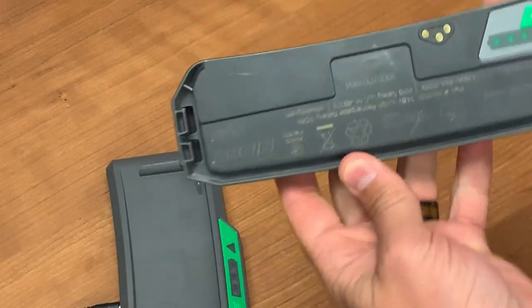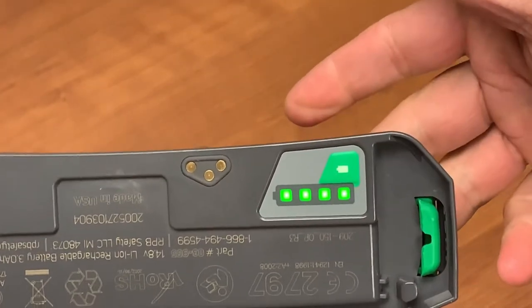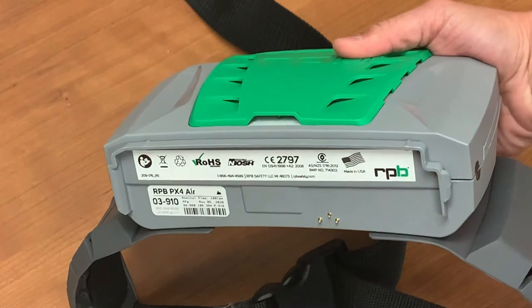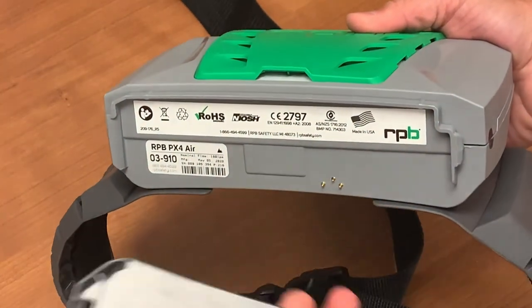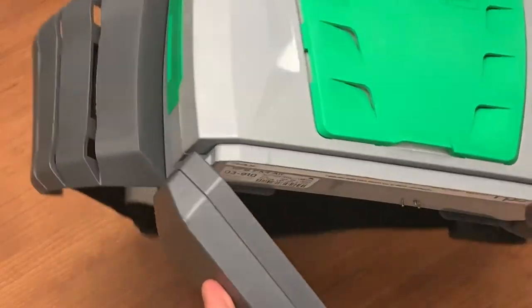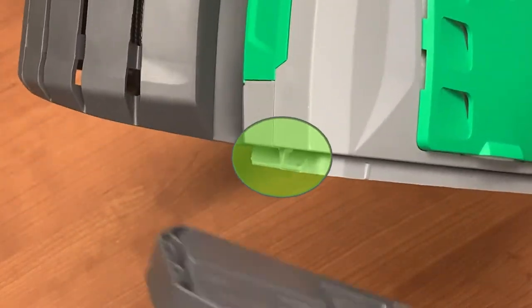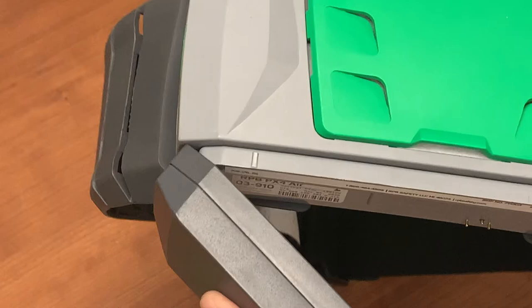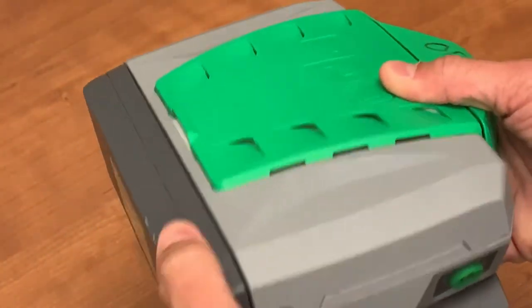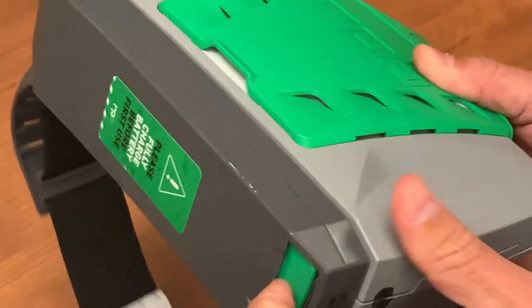On the underside of the battery, you can push the green soft key to display the current charge. The battery attaches to the bottom of the PAPR. Matching the three metal prongs on the unit to their counterparts on the battery will give you the correct alignment. Hook the battery to the plastic hinges on the side of the PAPR and swing it into position until you feel and hear a click. If you need to remove the battery, depress the green button and pull away from the unit.